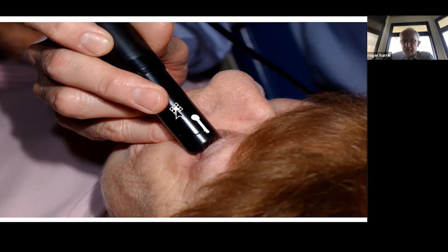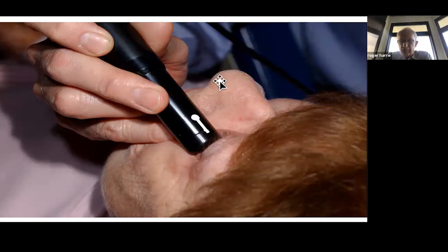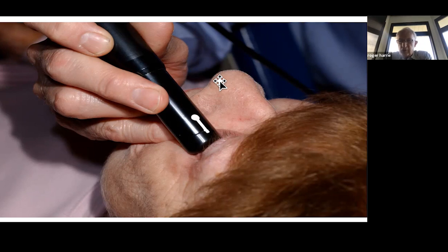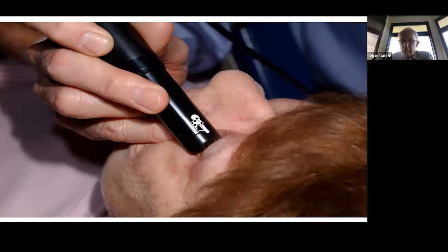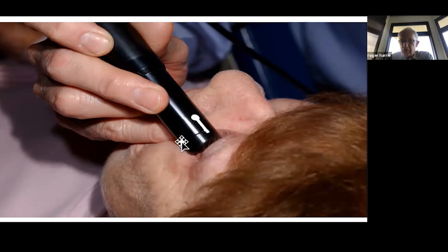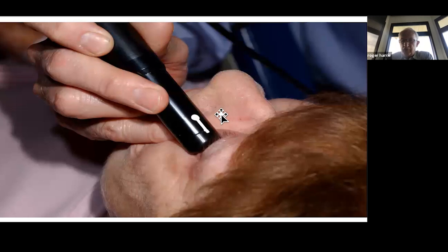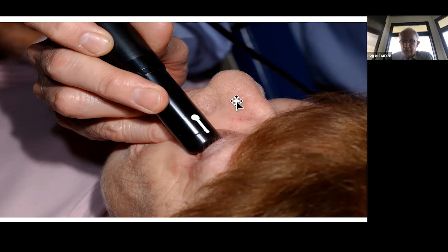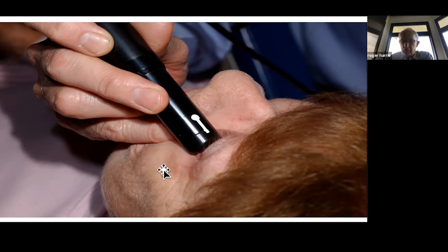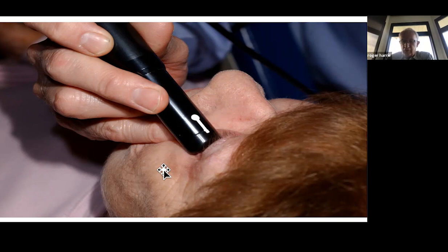Every B-scan has a marker — either a line or dot — indicating which direction the transducer is moving inside the probe. The transducer does not rotate; it moves in either a horizontal or vertical plane. The marker's position tells you which direction the transducer is sweeping, which is critical for interpreting probe position and image orientation.